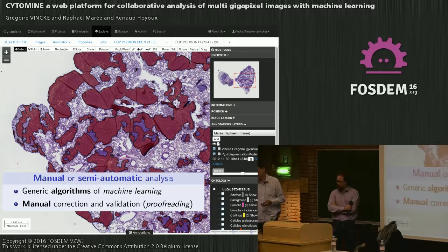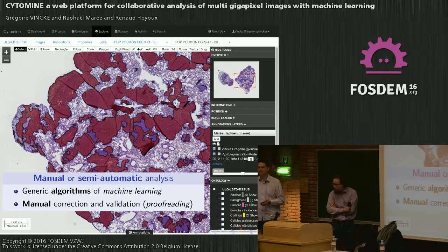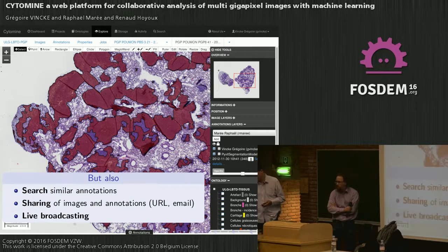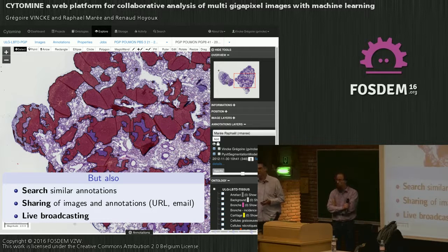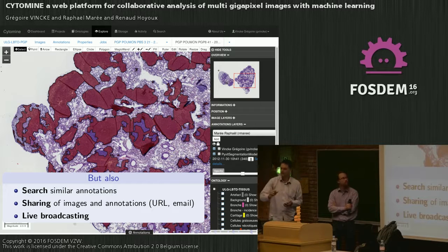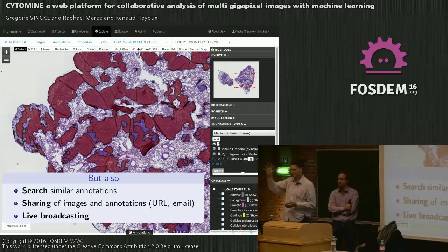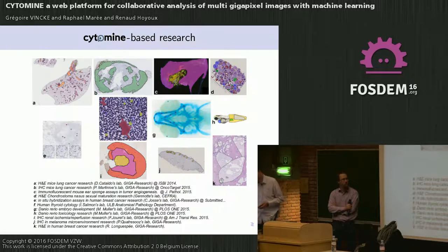For example, there was a study on lung cancer where the software was trained to detect all areas of cancer in the lung. It can also search for similar annotations in the slide, share images with a colleague via a simple URL in an email, and you can do live broadcasting to share your screen with a colleague for advice — they see exactly the same screen, and when you move your view, theirs moves too.